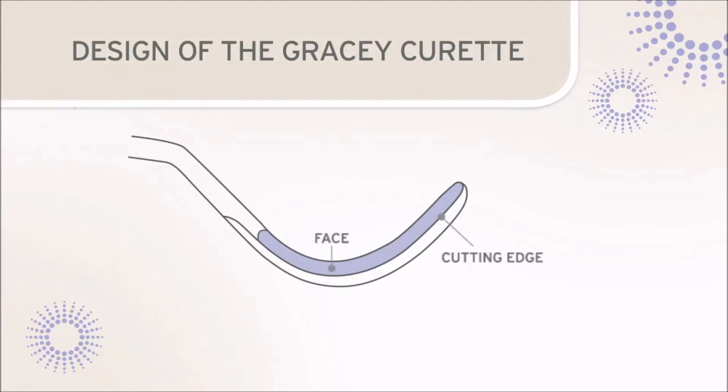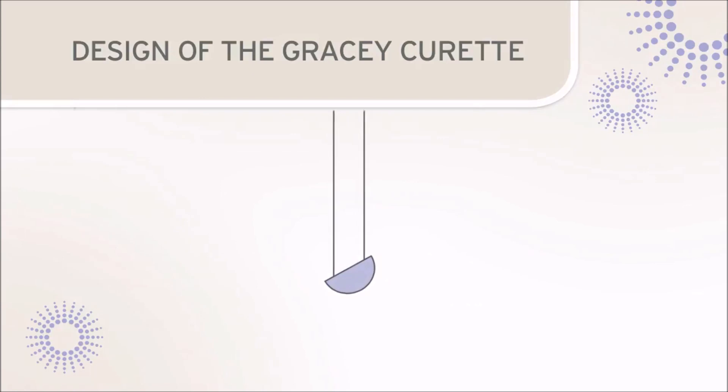This functional cutting edge is the lower edge of the Gracey curette. The undersurface of the Gracey blade is rounded, and the cross-section view reveals a tilted semi-circle blade shape.